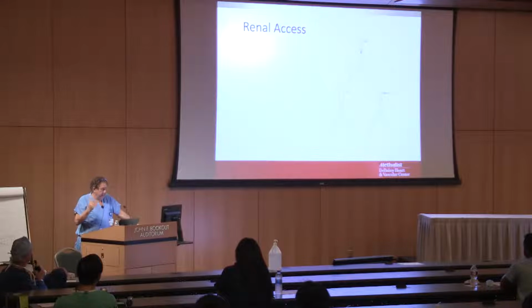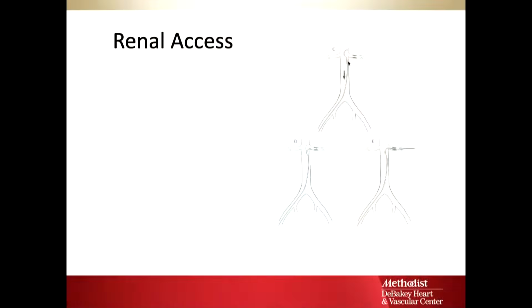And anyway, there's different ways of doing it. Again, catheters always go in straight. Okay, the preformed catheters, you just need to know a variety of these shapes. And the C2 catheter, which is the other one that's up in that model, you have to place the tip of them above the target, because when you pull the wire back, you put in a straight catheter, you pull the wire back, the catheter reforms and it shortens up. And so if you put the tip of it below the renal artery, then you're going to be 2 to 3 centimeters short by the time this catheter reforms.